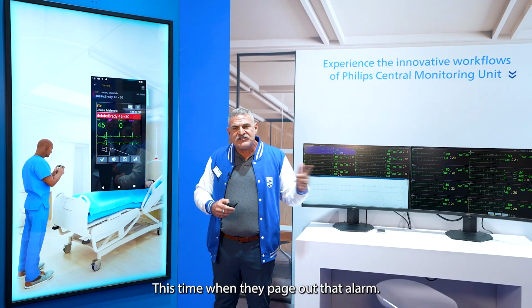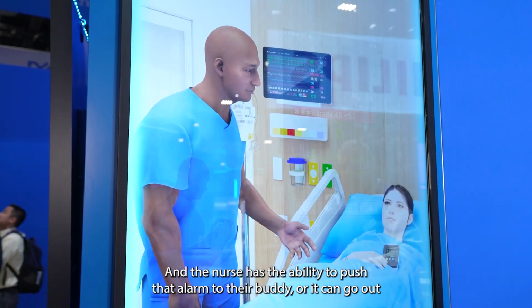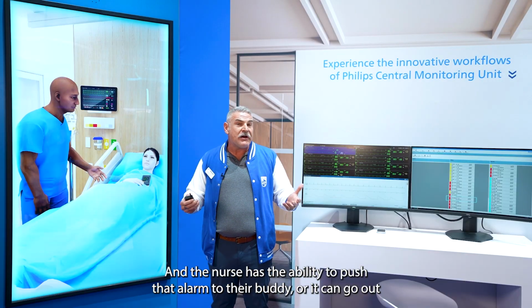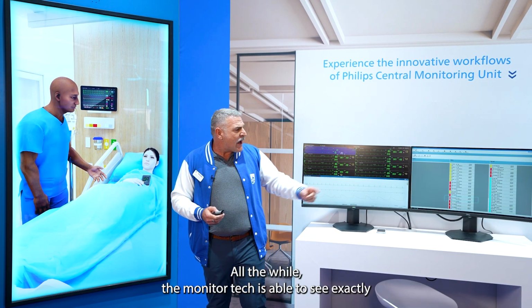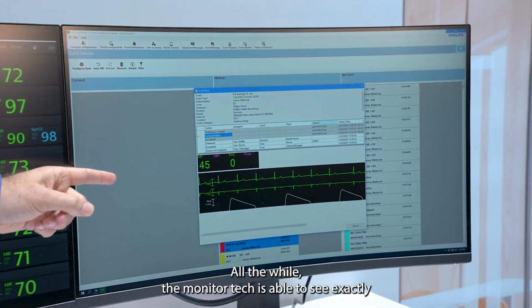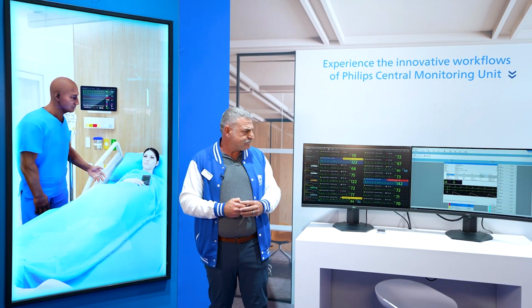This time when they page out that alarm, it's going to go to the nurse, and the nurse has the ability to push that alarm to their buddy. Or it can go out automatically after a certain amount of time if that nurse is busy. All the while, the monitor tech is able to see exactly what's happening with that alert to know that somebody is taking care of it.